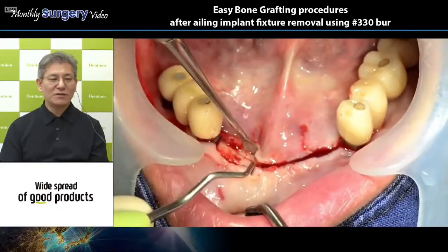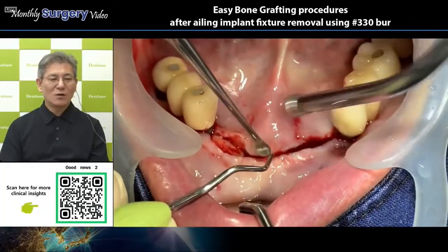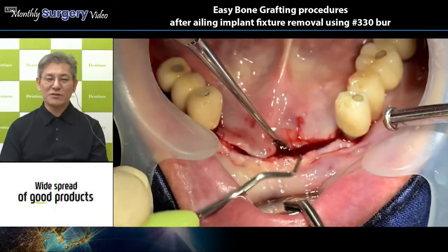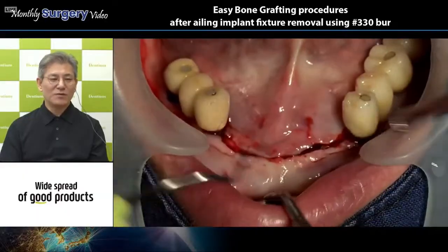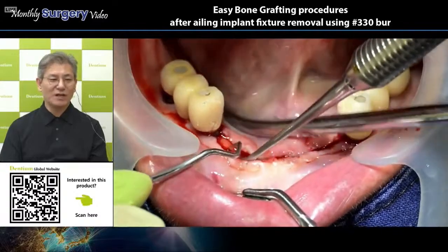As I mentioned before, these lower anterior mandibular areas gave us a lot of history about the treatment and procedure. Why? They already installed implants at these 33 areas.